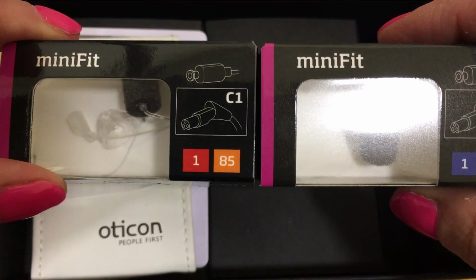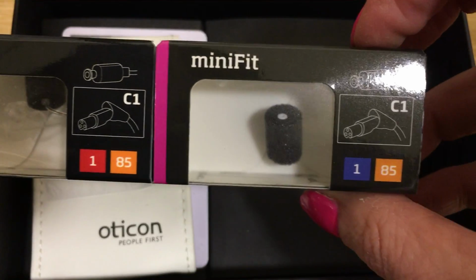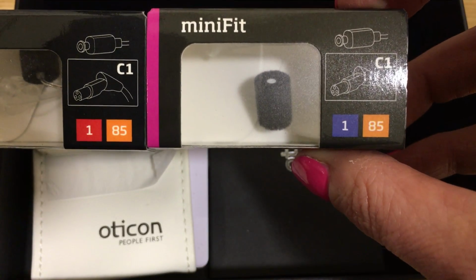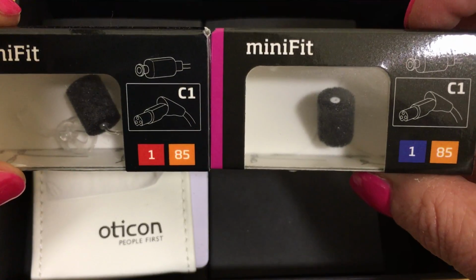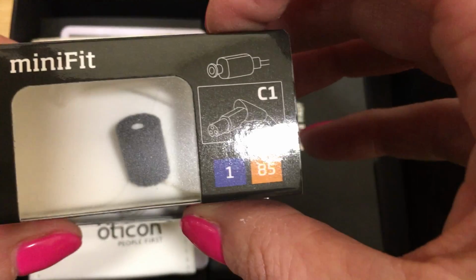These speakers come in two strengths, the 60 decibel speaker and this 85 decibel speaker. The 85 being a slightly more powerful speaker, fitting hearing losses in the moderate to moderate severe fitting range.